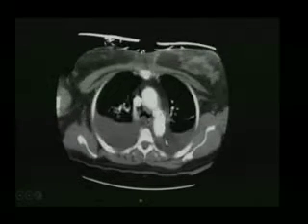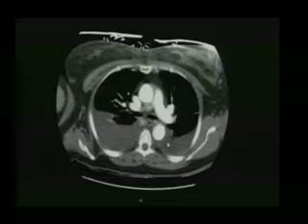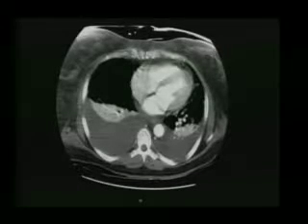So this is the follow-up CT scan. She has more pleural effusions on both sides now. You can see the subclavian, left carotid, innominate, coming down, the stent graft, descending aorta. So the injury is excluded. This is the left subclavian, with the stent graft excluding the injury. No evidence of any endoleak and no evidence of any other proximal or distal intimal flaps on this image.